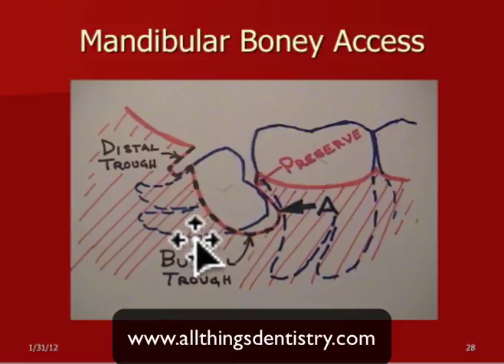You want to get toward the apex, not toward the crown. And a little distal trough, because this tooth isn't going to go straight out, it's going to make a curve here, so you have to have a little room there. Just stay one bur width behind. Don't go too far back there. Your lingual nerve and other anatomical features are out there.